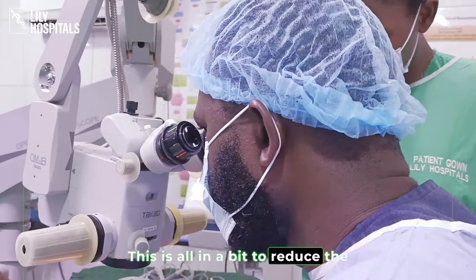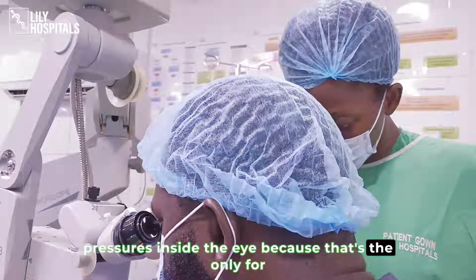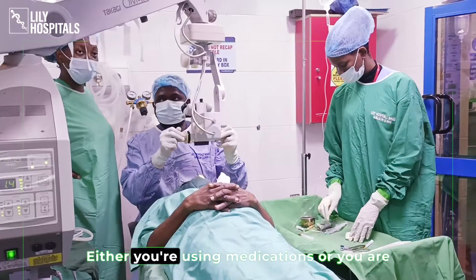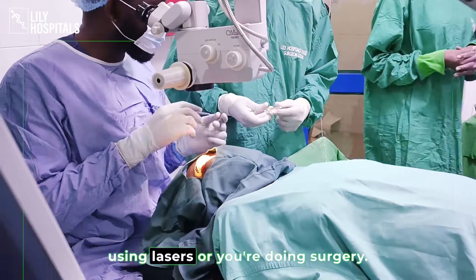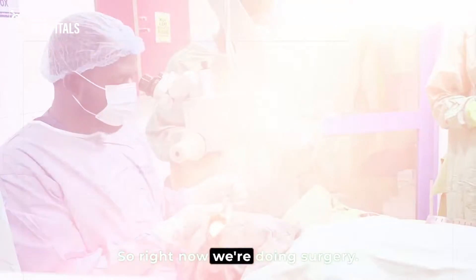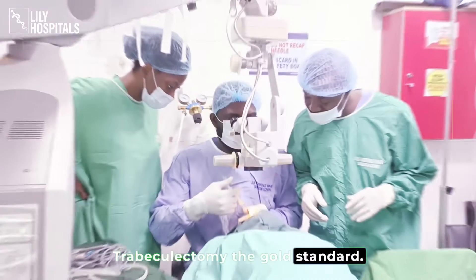This is all in the bid to reduce the pressures inside the eye, because that's the only treatment for glaucoma for now. It's either you're using medications, or you're using lasers, or you're doing surgery. Right now we're doing surgery with a trabeculectomy — the gold standard.